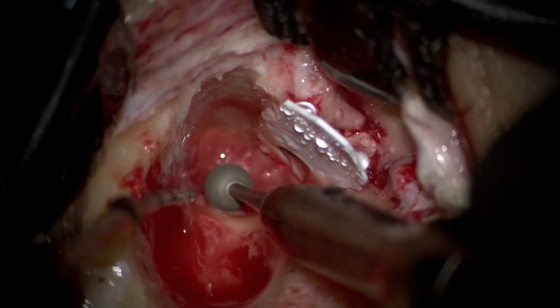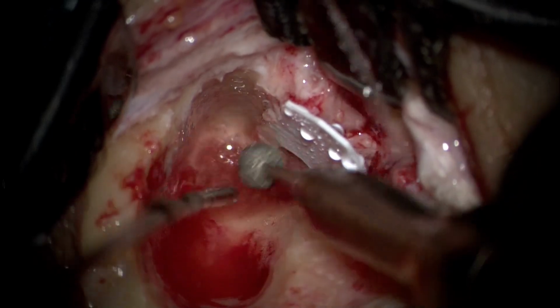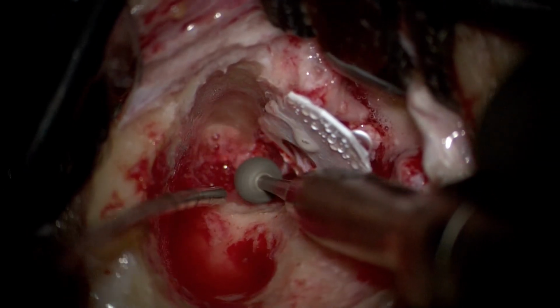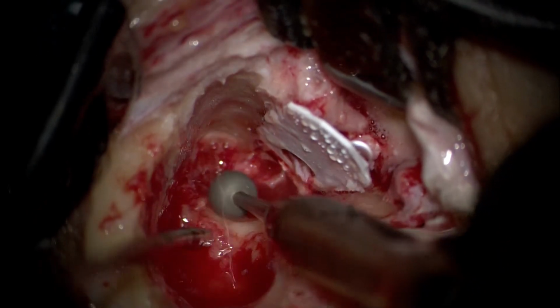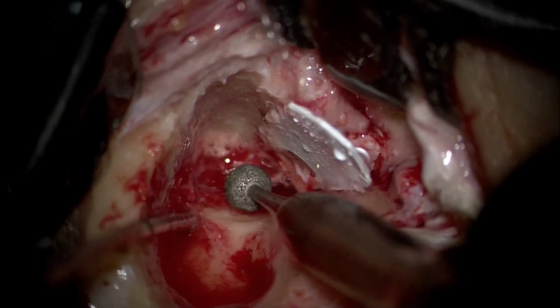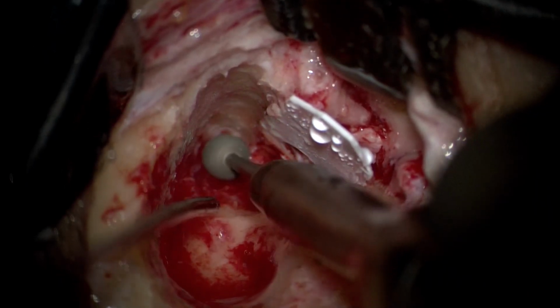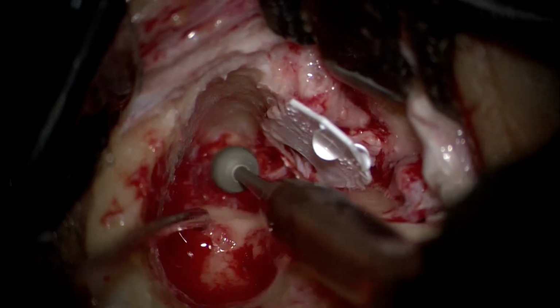And it is always thinned on the anterior aspect, not preferably on the posterior aspect, because we want it broad, we want it smooth. But for the appropriate clearance of the posterior mesotympanic recesses, the sinus tympani, we want to be thinning this facial ridge anteriorly, that is basically the posterior canal wall lateral to the posterior mesotympanic recesses, so as to get as broad a view as possible of the posterior mesotympanic recesses and the sinus tympani, which is often the site for disease in these patients.